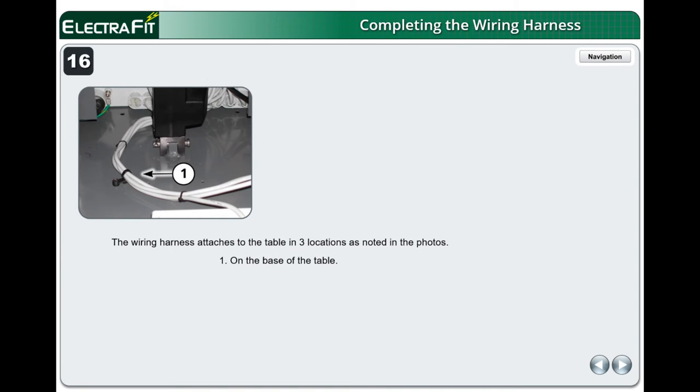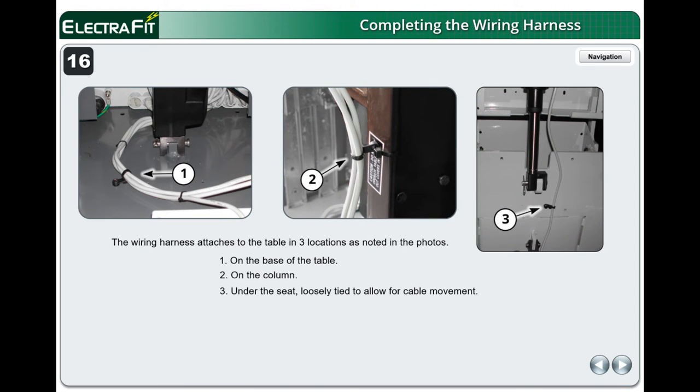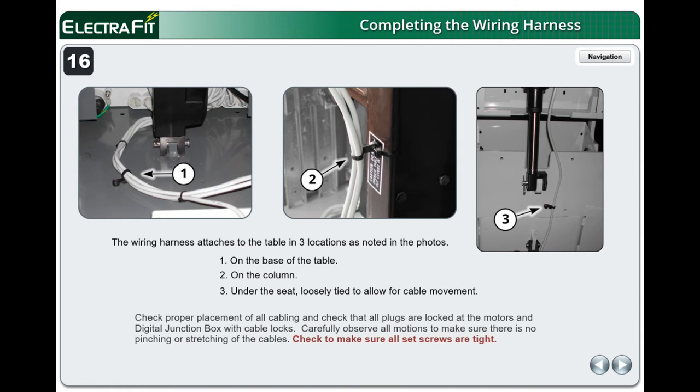The wiring harness attaches to the table in three locations: 1 on the base of the table, 2 on the column, and 3 under the seat, loosely tied to allow for cable movement. Check proper placement of all cabling and check that all plugs are locked at the motors and digital junction box with cable locks. Carefully observe all motions to make sure there is no pinching or stretching of the cables. Check to make sure all set screws are tight.